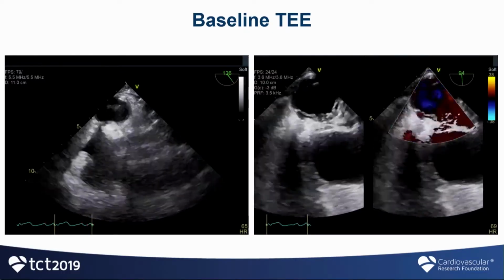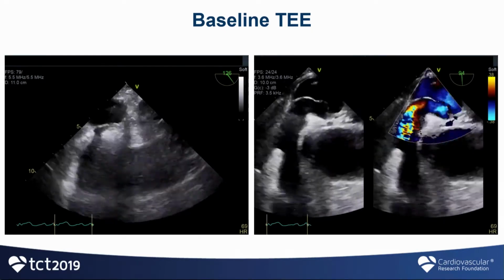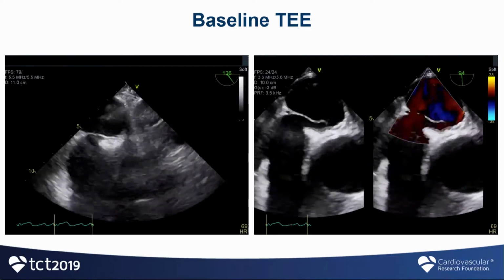The first thing I'm looking at here is that this is a transesophageal echo that outlines the anatomy very well. It's our challenge as interventionalists, if you're going to do your closures with intracardiac echo, to be able to reproduce the quality and the detail of this image with your imaging technique. If you don't feel that you have that level of expertise with intracardiac echo, I would favor doing these cases with transesophageal echo, because the complexity is such that without good imaging, this would be a very challenging and potentially unsafe closure.